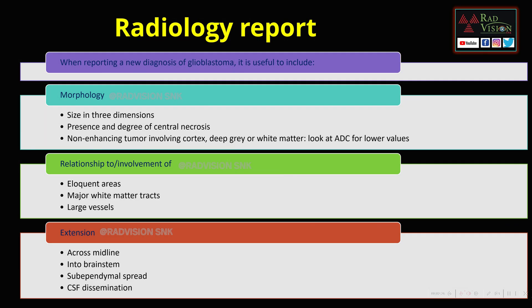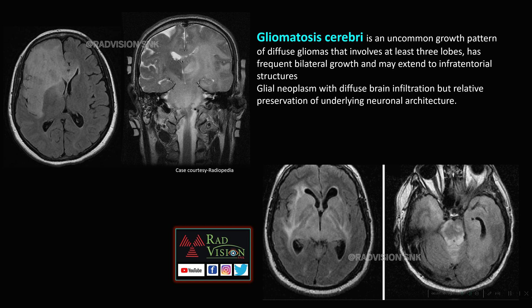Another variant is gliomatosis cerebri, an uncommon growth pattern of diffuse gliomas involving at least three lobes. Cases show a diffuse infiltrative lesion hyperintense on FLAIR in the left cerebral hemisphere extending into the capsulo-ganglionic region, infiltrating the brainstem and reaching infratentorial locations, and bilateral capsulo-ganglionic regions extending into right frontal lobe, bilateral temporal lobes, and brainstem. It has frequent bilateral growth and is a glial neoplasm with diffuse brain infiltration but relative preservation of underlying neuronal architecture.